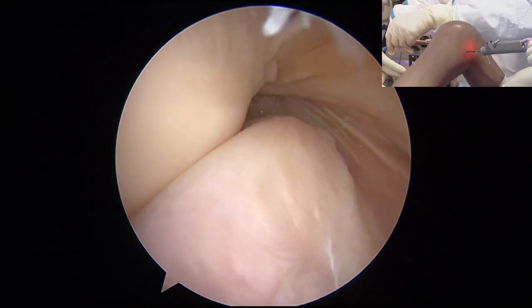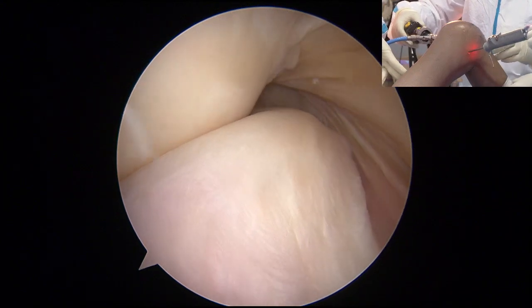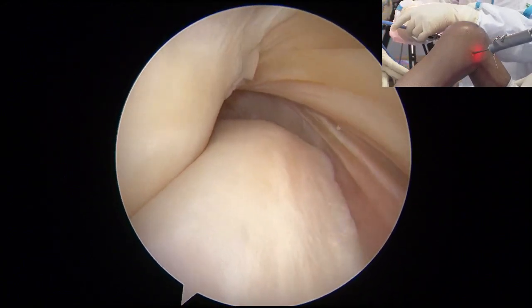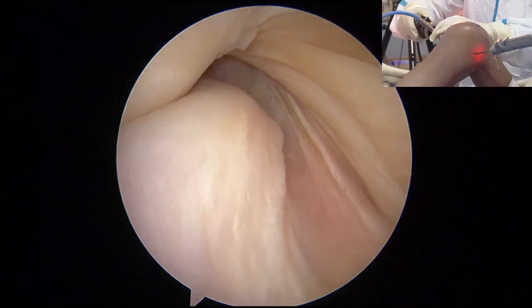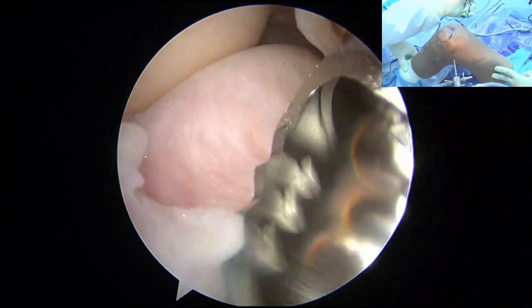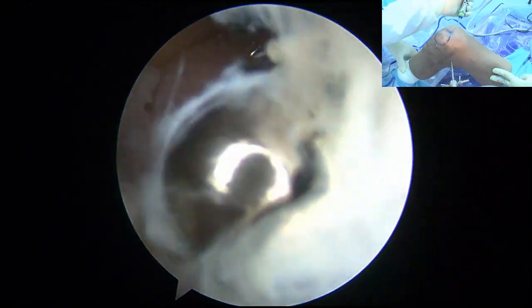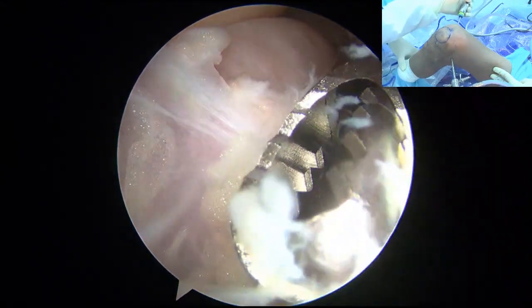Okay, you turn this way, you see the... And also, I use this portal for my RAMP lesion repair. Because you read my articles in Arthroscopy Techniques, we do the RAMP repair using this portal. You can see very well, up to here, because sometimes the RAMP lesion extends to the very medial. You can see better than when you're looking from the notch. This portal is also used for RAMP meniscal lesion repair, published in Arthroscopy. Because RAMP lesions are sometimes very medial, the transnotch approach may not always find them, but the posterior transseptal approach can find and repair them well.